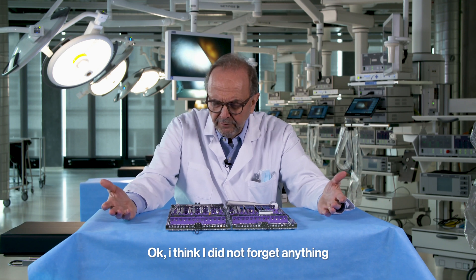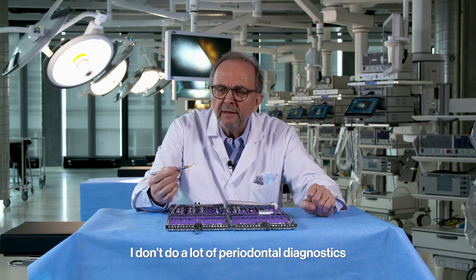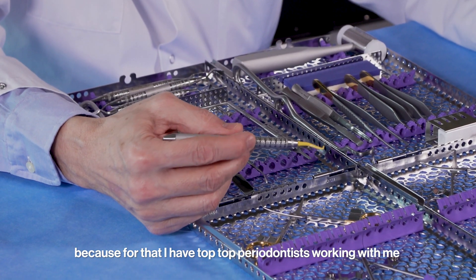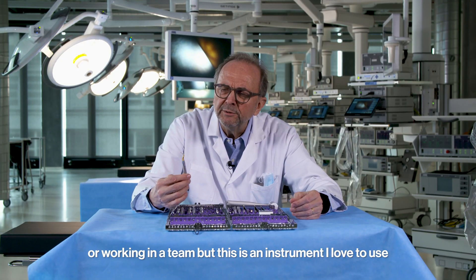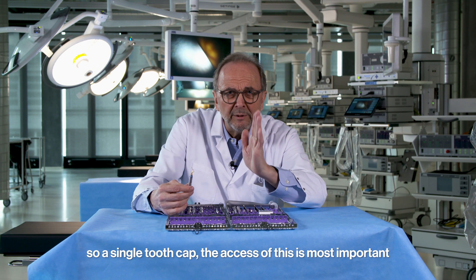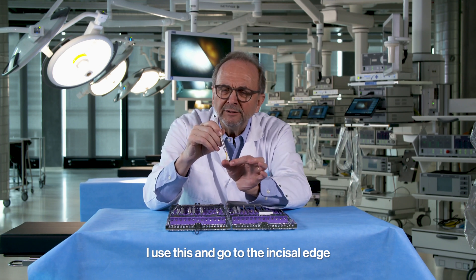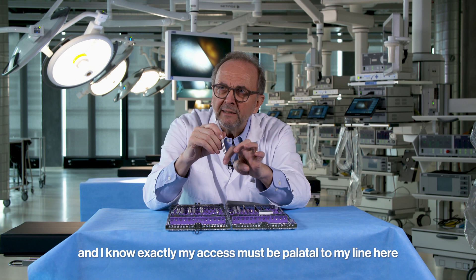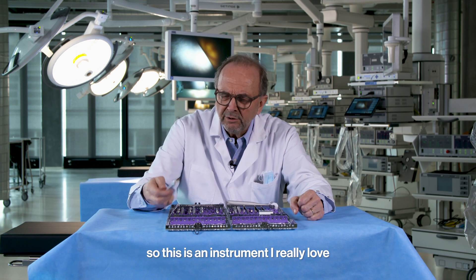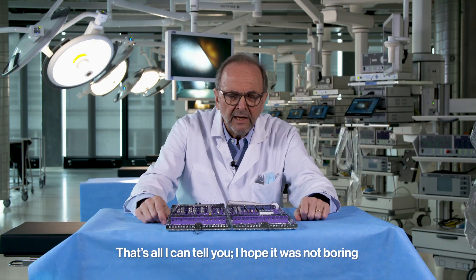Something I almost forgot — a periodontal probe. You might be surprised, as I'm an implant surgeon and I don't do a lot of periodontal diagnostics. But this is an instrument I love to use in implant surgery to orient myself. In a single-tooth gap, the axis is most important. When preparing the implant bed, I use it to go to the incisal edge and confirm my axis must be palatal to that line. I can also use it to compare where the CEJ is.